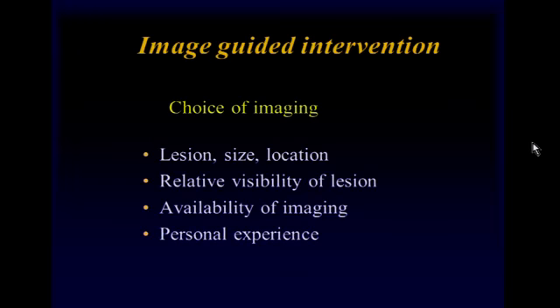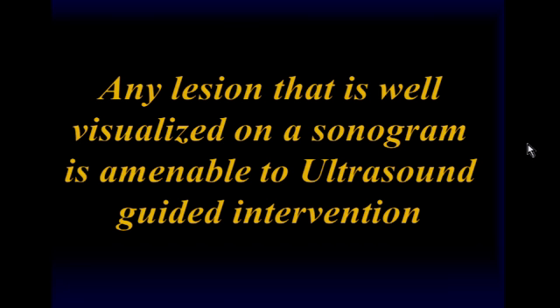Now, when we choose an imaging modality for intervention, it all depends upon the lesion itself, its location, size, relative visibility, availability of imaging modality, and the personal experience. But by and large, any lesion that is well visualized on a sonogram is amenable to ultrasound guided intervention.